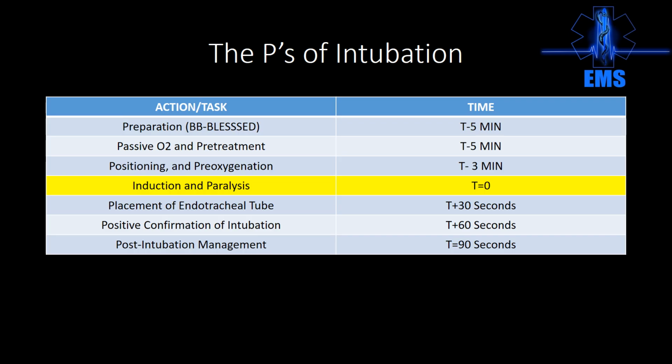But we're waiting until we get a flaccid jaw, and then we're inserting the blade, whether that be a VL, preferably, or a DL, and locating the epiglottis, which is again locating the cords. We're going to pass the tube and place the tube at the right location, again using that black line at the bottom of the ET tube if it exists. If it doesn't exist, you want to view the balloon going through the cords, advance about 1 to 2 centimeters more, and stop. We're going to inflate our pilot balloon, and we're going to get positive confirmation of the ET tube.